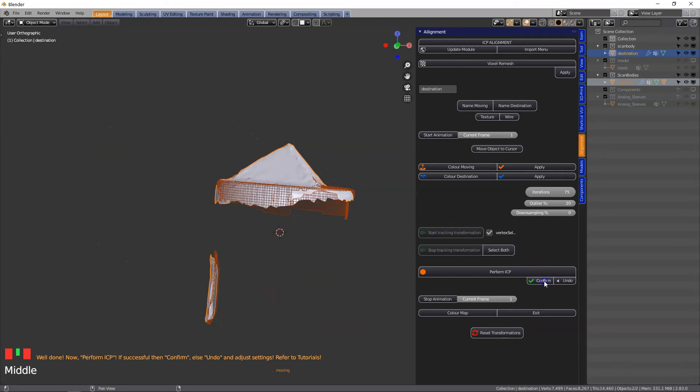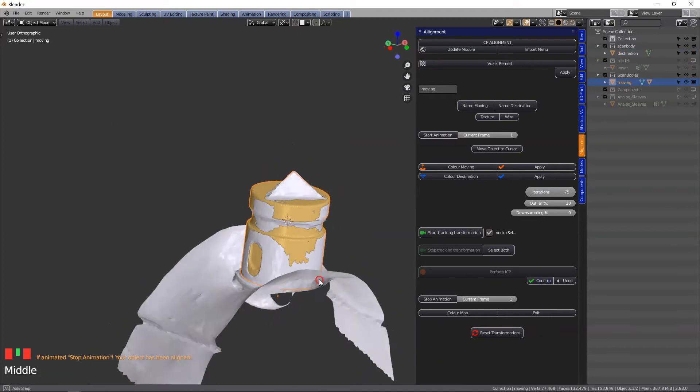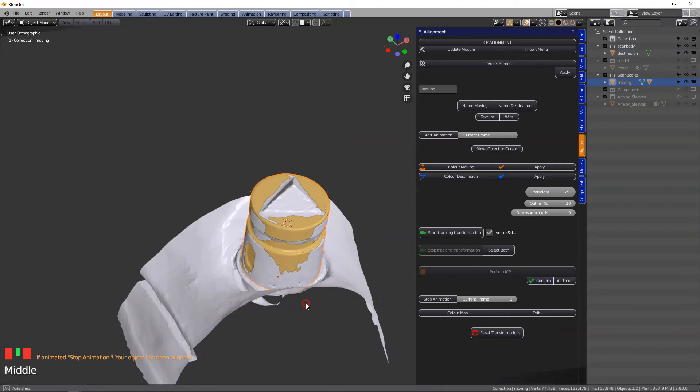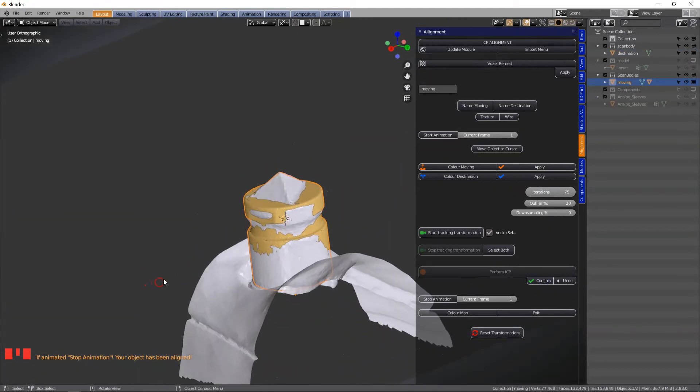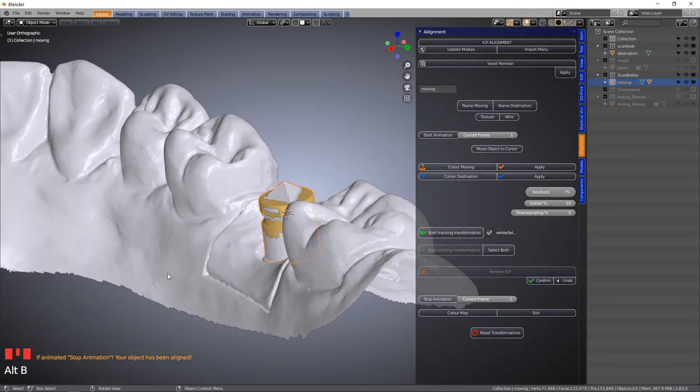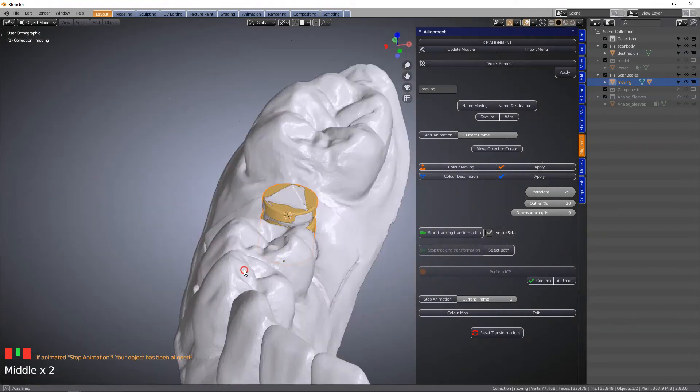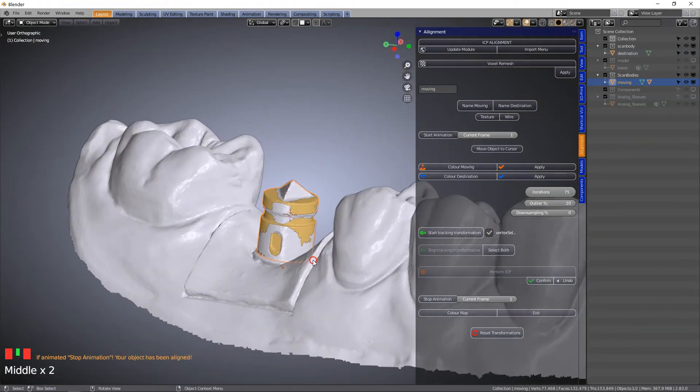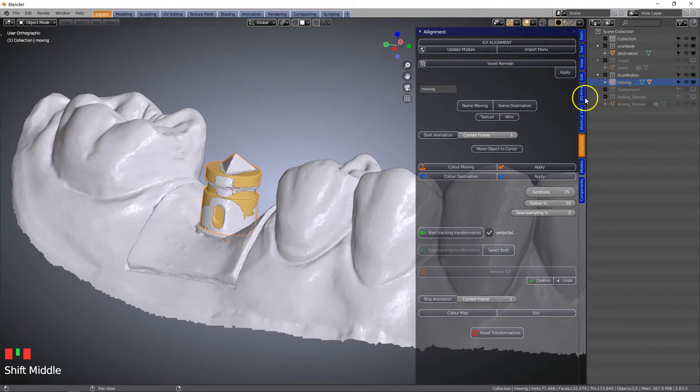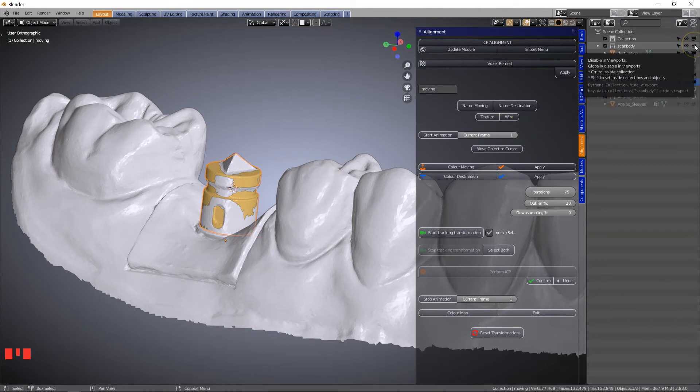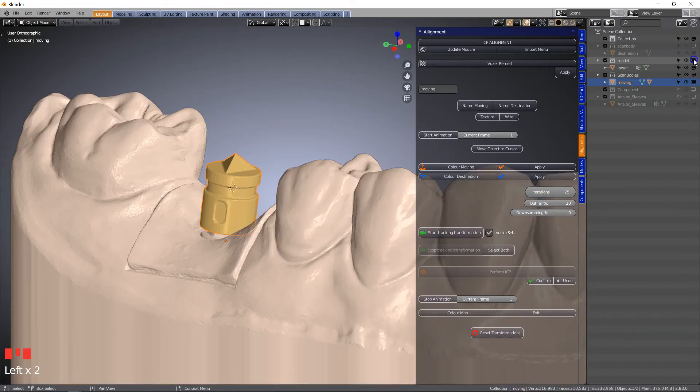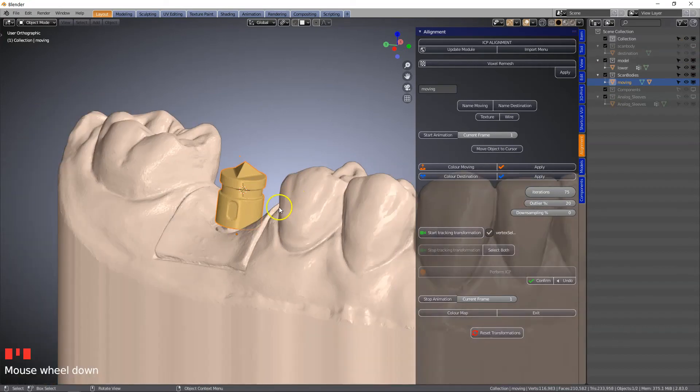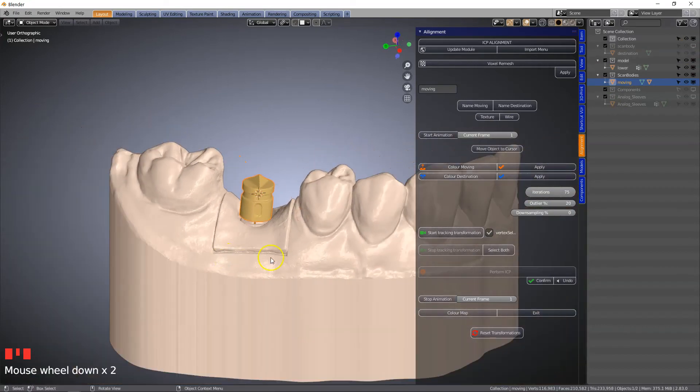Then we're going to click on confirm and then continue making our model. Alt B to exit. Now that we've aligned it we can hide the scan body. We don't need the scan of the scan body anymore and we're going to view our model.